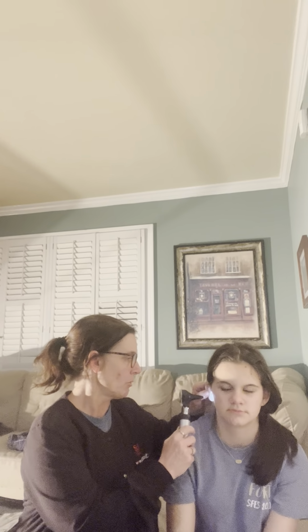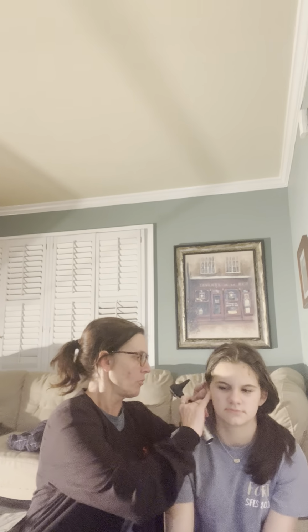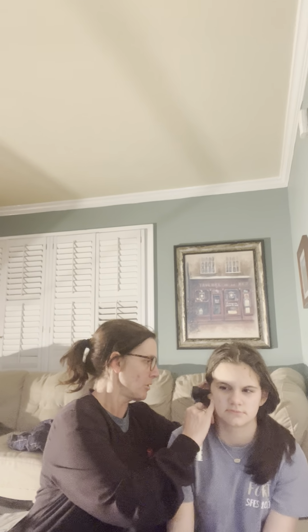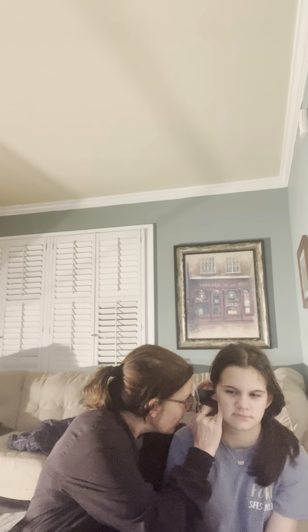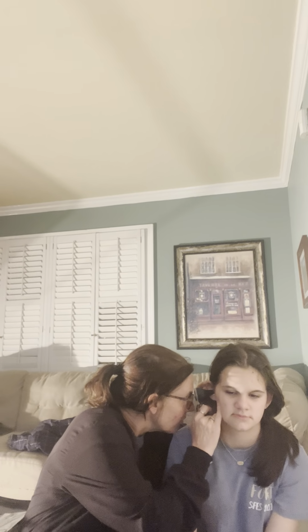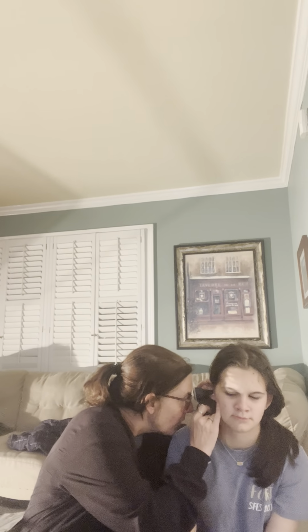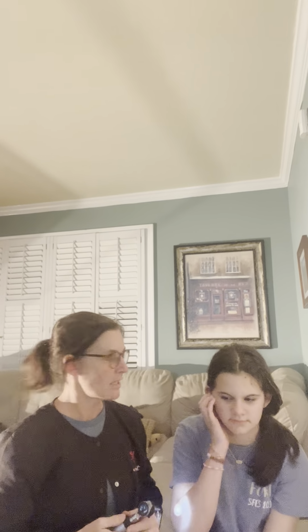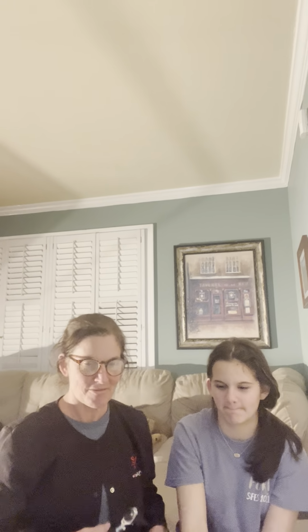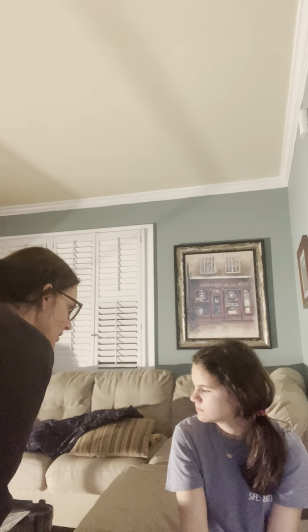So with the adult, I would pull the ear back and up, and I would put my finger here to balance it and make sure it is good. Okay, and I see the markers and I see the reflective light at about 5 o'clock. Her eardrum is gray and pearly, and it looks normal. There is some wax in the ear that I did observe, so I would tell her that there was wax in her ear. So that would be the exam of the ear.